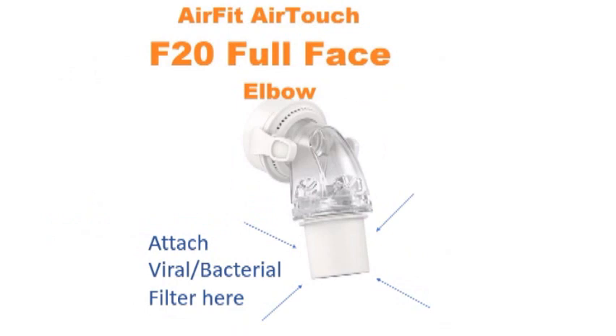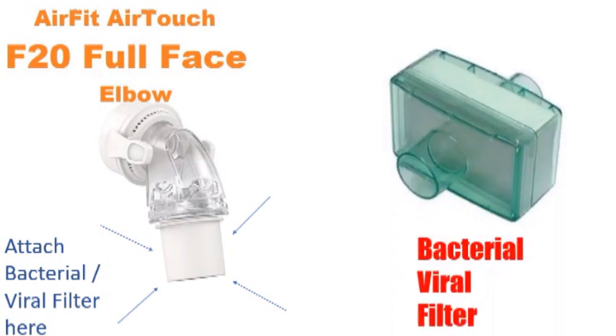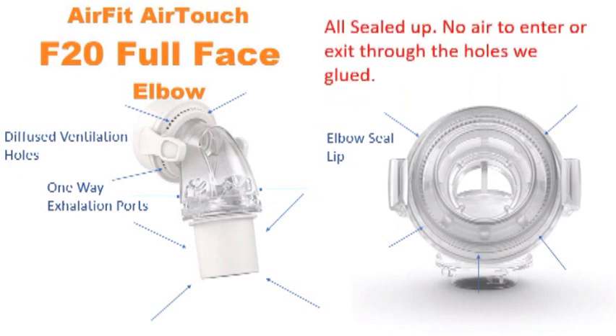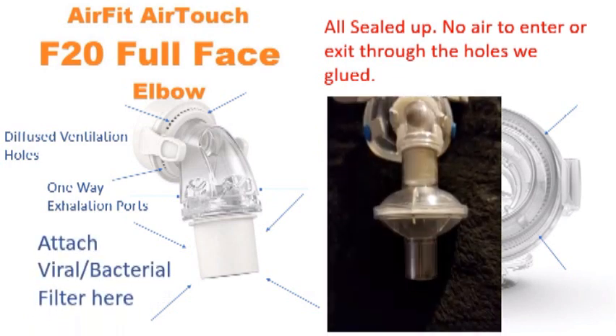At the very bottom of the elbow is where the viral filter attaches to the mask, cleaning out the air that you're breathing in and out. To review: you've got your diffused ventilation holes, your one-way exhalation ports — all hot glued — and a little bit of hot glue on the back of the elbow seal. No air should enter or exit through those glued holes. Then at the end you attach the viral filter at the bottom, and that's what it looks like once attached.